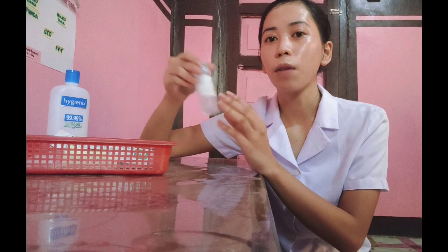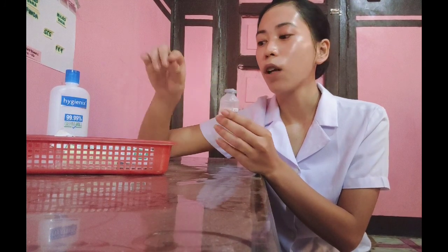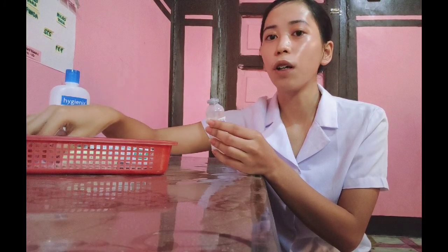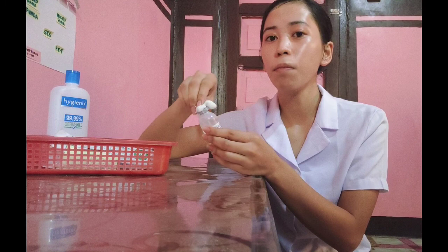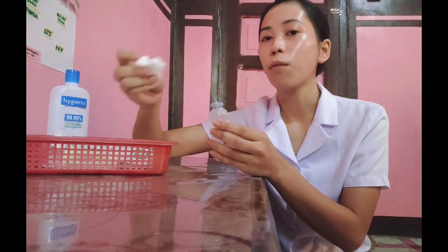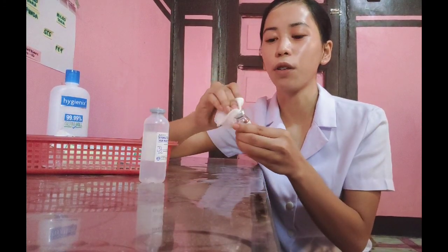And then read the manufacturer's directions. And then remove the protective cap or clean the rubber cap of a previously opened vial with an antiseptic wipe by rubbing in a circular motion.